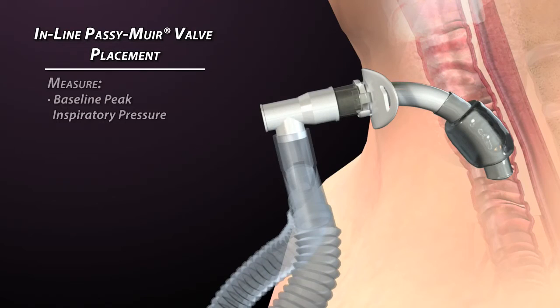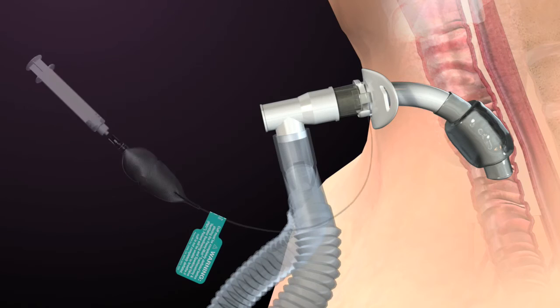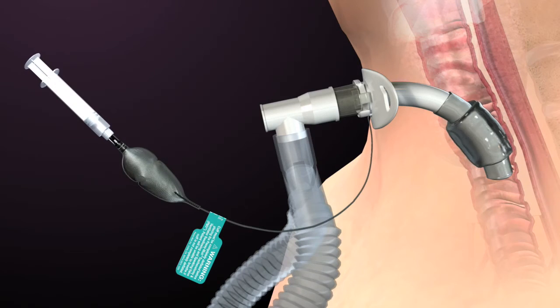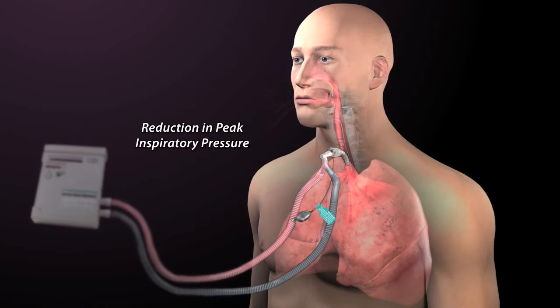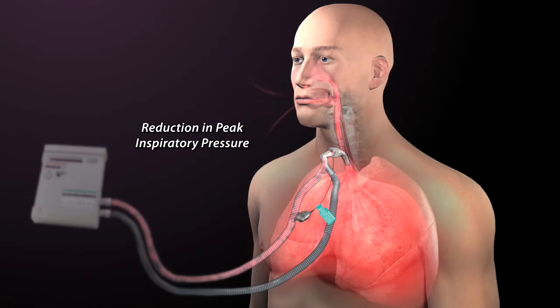Before cuff deflation, baseline peak inspiratory pressures and exhaled volumes should be noted. Once the cuff is completely deflated, volumes and pressures are reassessed for any changes. During inhalation, a reduction in peak inspiratory pressure may be observed as volume escapes or leaks through the mouth and nose.